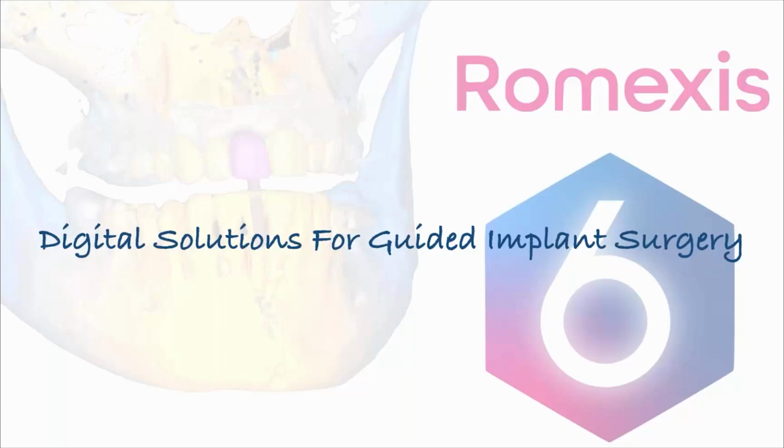But I can't think of a better testament than this for Romexis, which is our perio residents who I spend the most time with. They really have their choice of the major implant planning software systems. And I find that they gravitate towards Romexis when they're planning their cases on a day-to-day basis. There are some reasons for that, and I'll share those. But I can't think of a better testimonial than that people who are given the freedom to choose tend to use this one, because not only is it powerful, but it's also very, very elegant and very easy to use. So we'll definitely discuss that more.